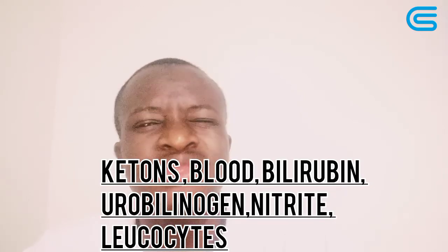The main advantage of the urine dipstick is that it is convenient. It is very easy to interpret, like we are going to do today, and it is cost effective. The main disadvantage is that the information in the test may not be very accurate, since the strip is very time sensitive. The longer it stays, the more it reacts, and the shorter it stays, the less it reacts. So interpreting it too early or too late might lead to false results.